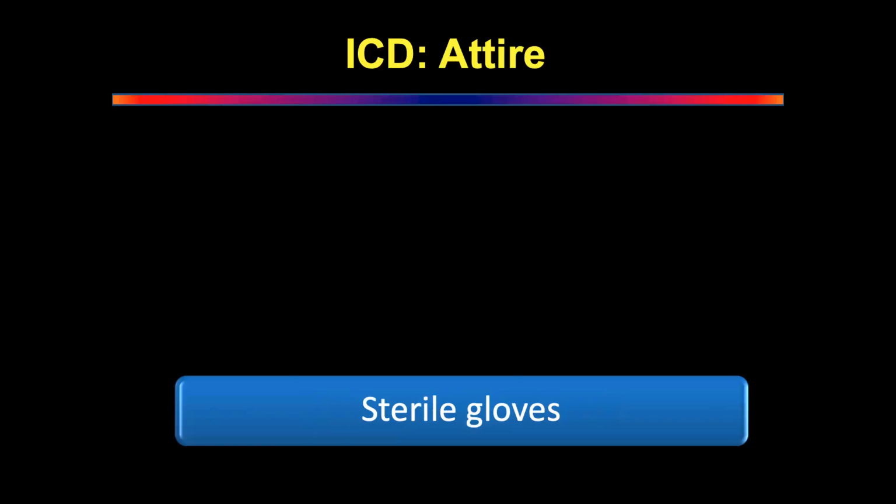What do you have to then wear? Sterile scrub gloves, OT dress. I'm sorry that's showing up, because it should be OT dress. And if you don't have OT dress, what should you minimum wear? What are the recommendations? OT shoes, and it should not be a full sleeve shirt; you should have half sleeves or the sleeves folded. Shoes are good, but what's the other side of the body?